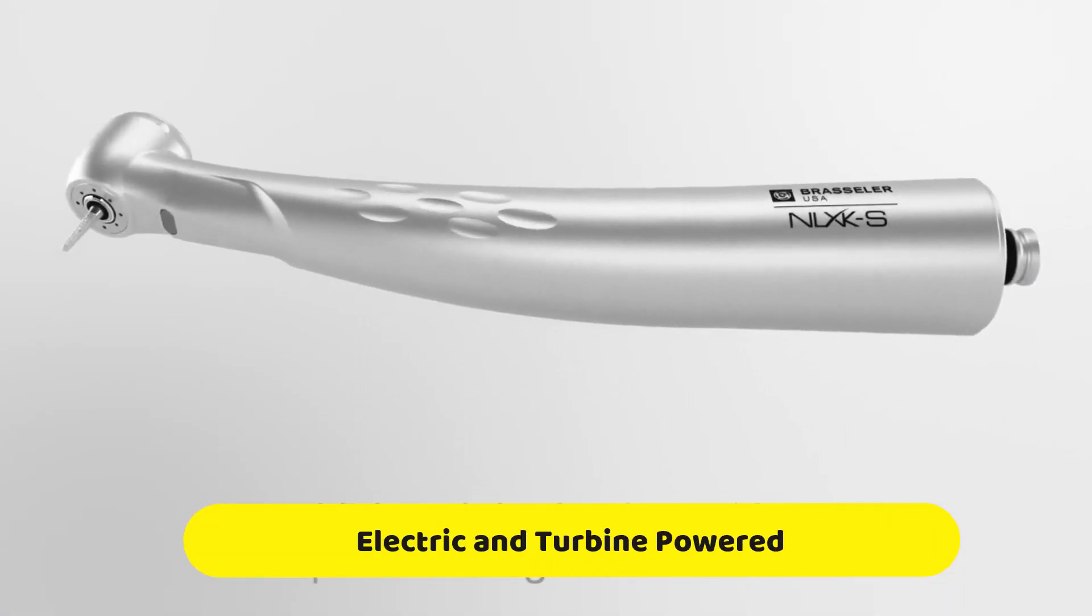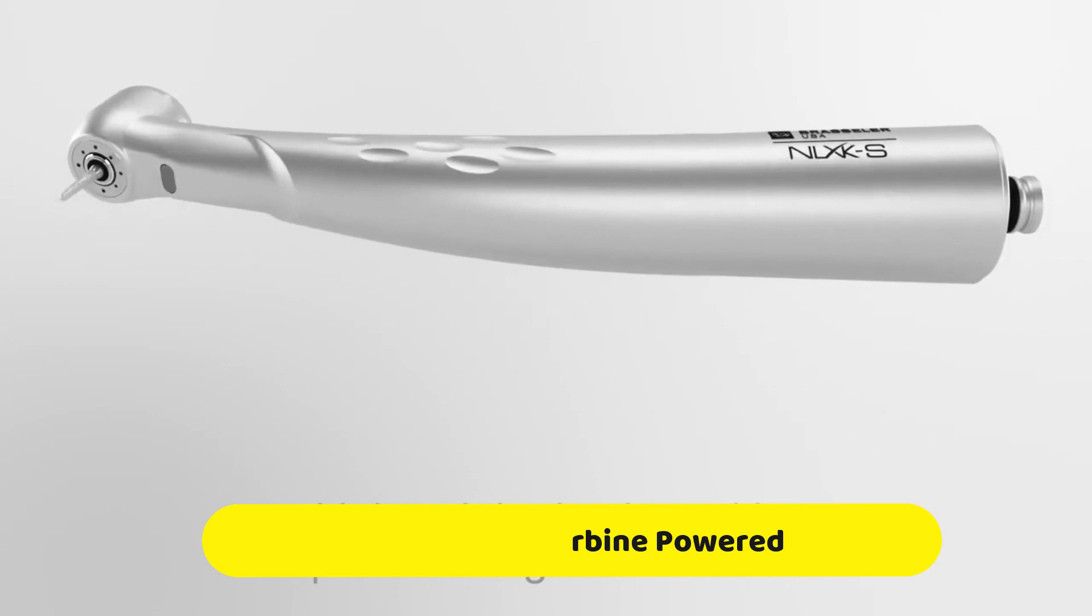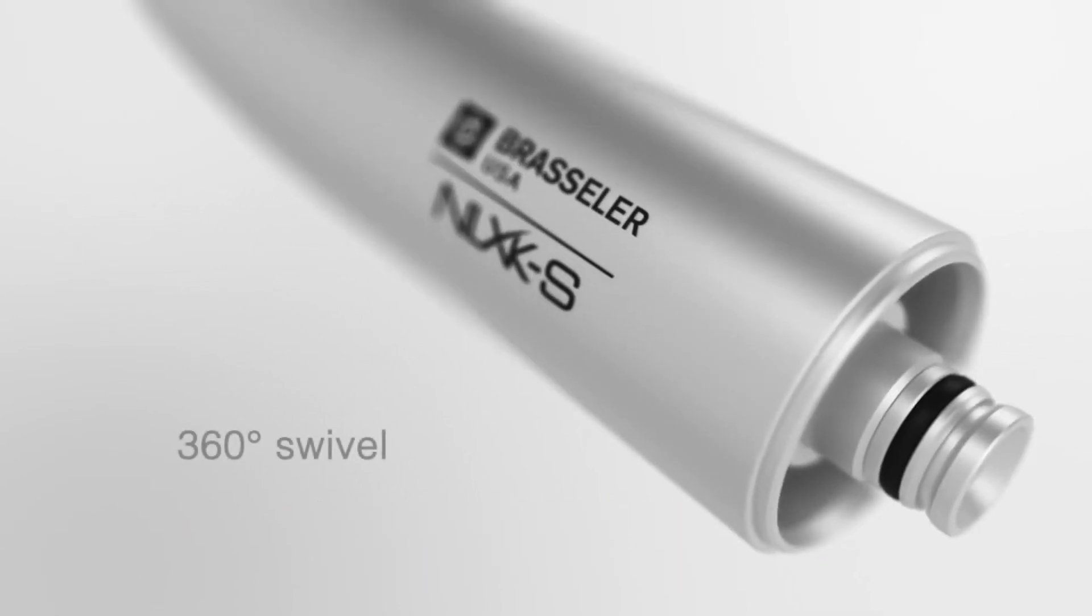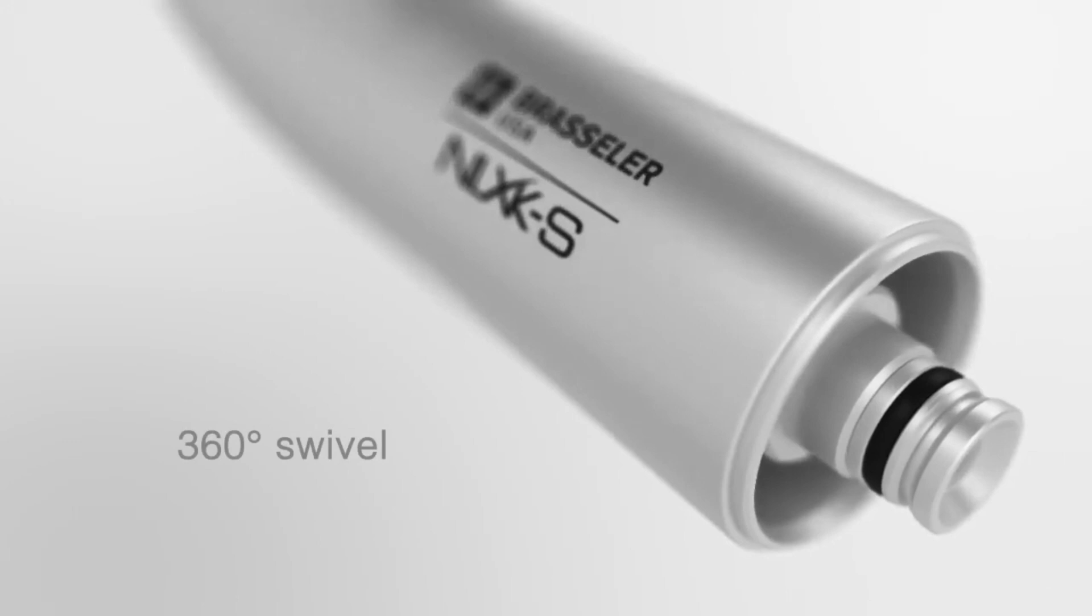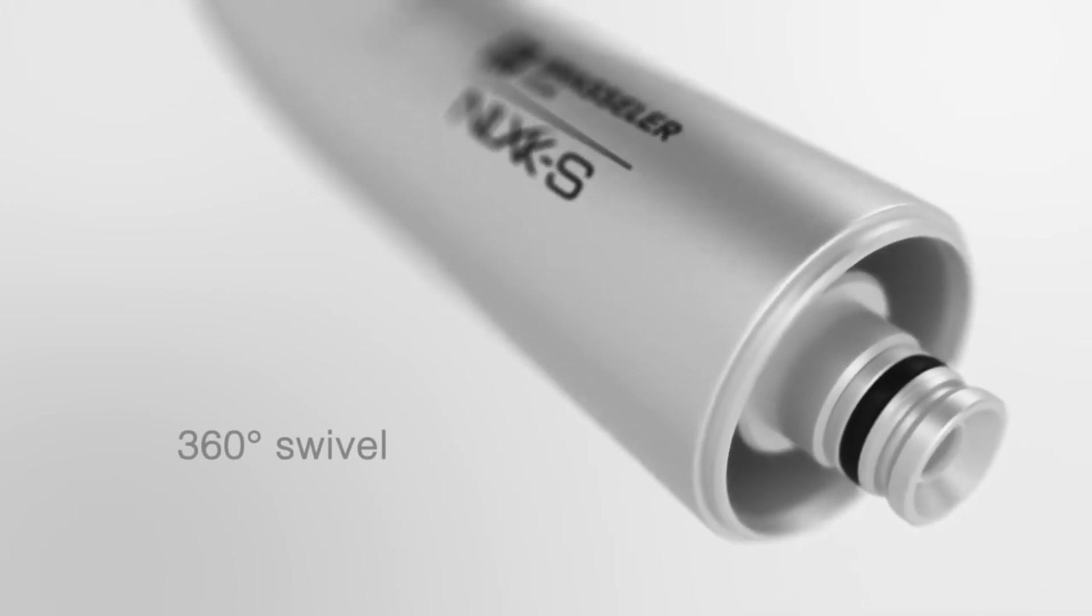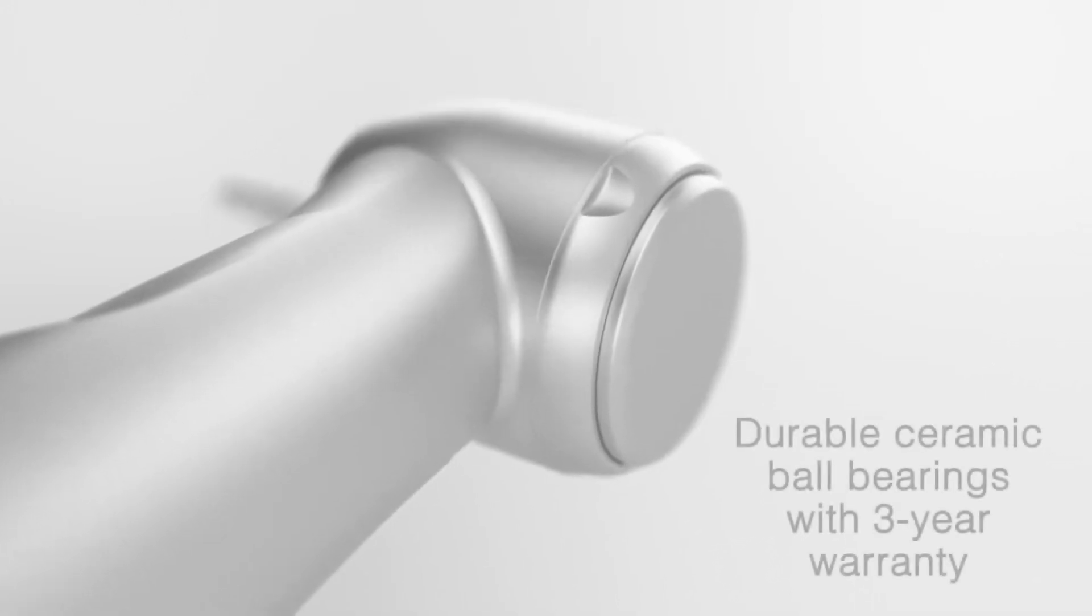The turbine-powered drills are the fastest out there. They use compressed air to rotate the drill head, known as a burr, over 180,000 revolutions per minute. That's super fast, and it's the reason why these types of handpieces are known as high-speed drills.